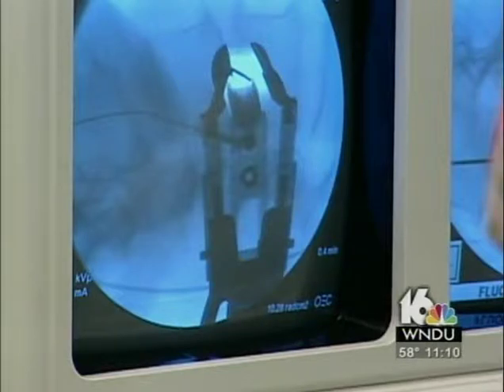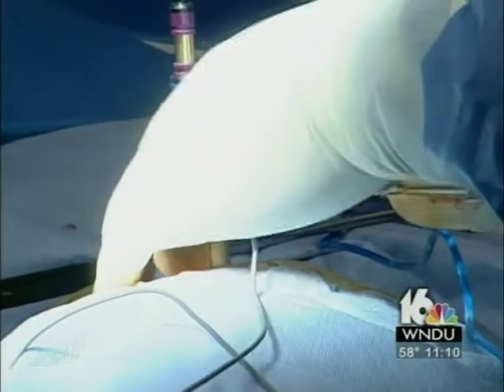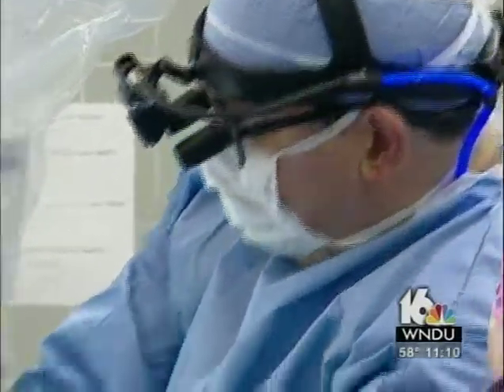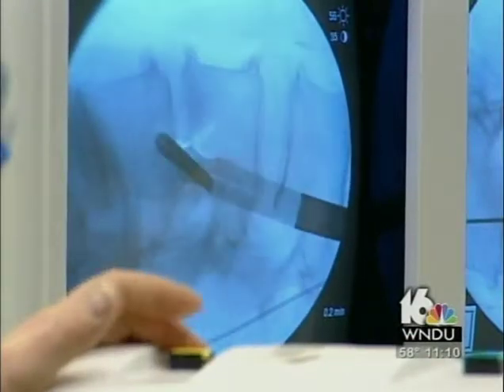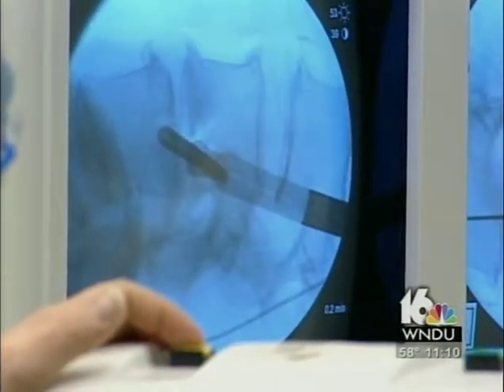That 3-inch incision is the only one Dr. Mango will make. We don't have to cut any of the muscles. We just spread them apart. And going in from the side, we're going to be away from the center axis of rotation of the spine, so it doesn't hurt as much. The guide wire is now down in the center of the disc. All right, so if you can see the monitor over there. Close monitoring lets Dr. Mango know where George's nerve is so he can stay clear.